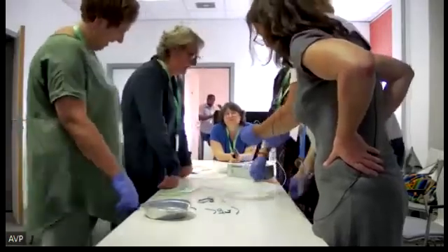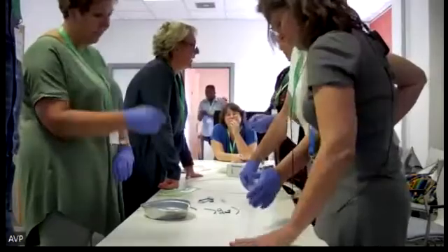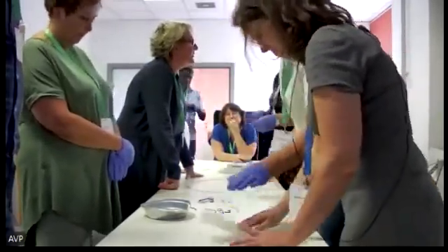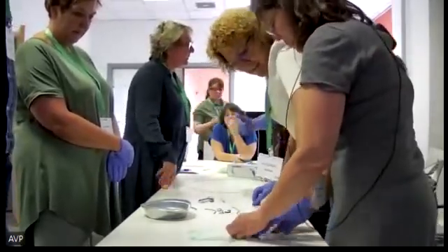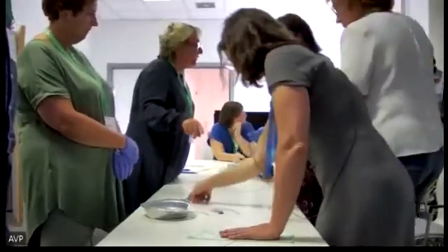So first you push your wire with the catheter in the bile duct. And so on, push. So this is the bile duct. No, this is the papilla. Okay. Then after that, don't forget to.